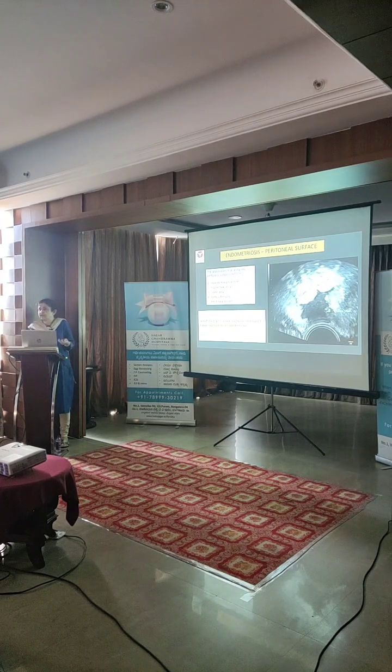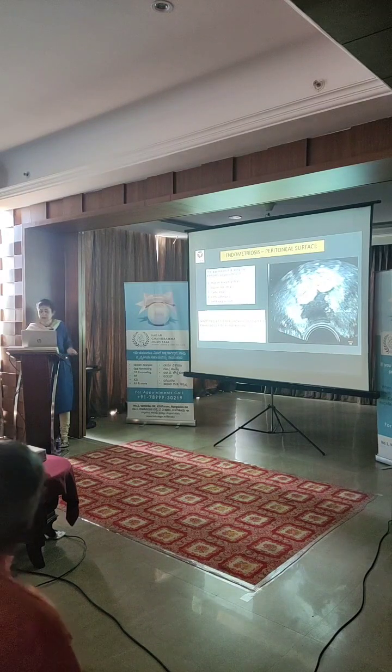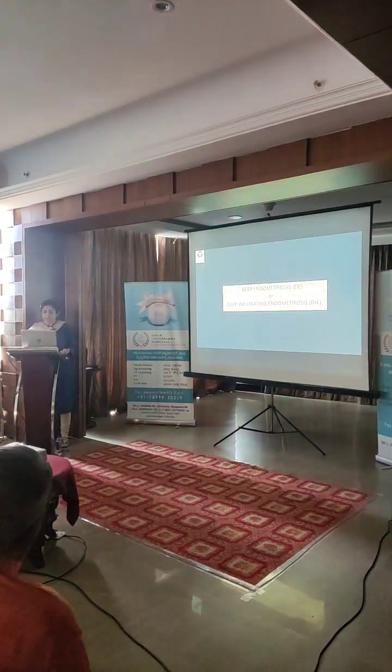So nowadays, I feel if you're looking at a patient with infertility, it may be a great idea to see it around ovulation, because you may have some fluid in the pouch of Douglas where you can assess superficial endometriosis. You can look for ovulation. You can look at the endometrium also. When she comes to you first time for a scan, the best time is to do a scan around ovulation.